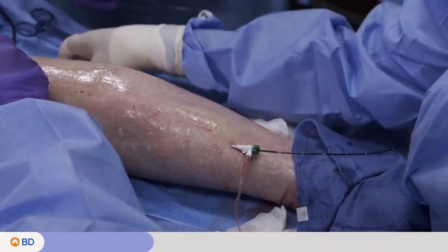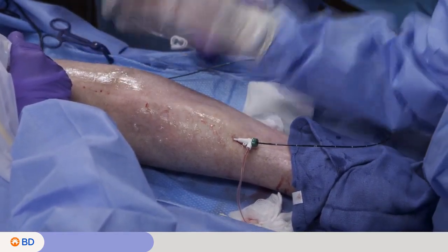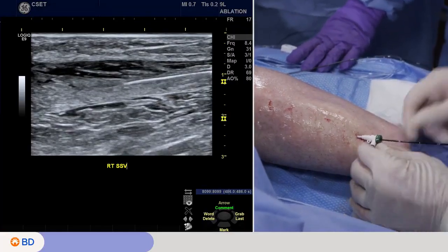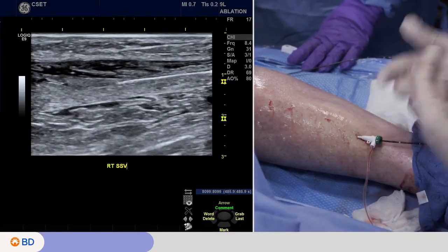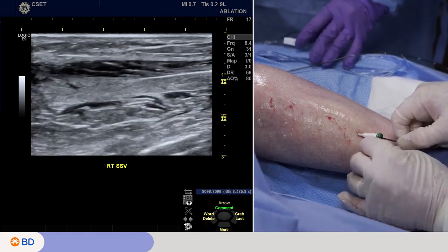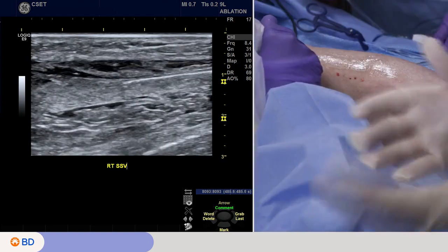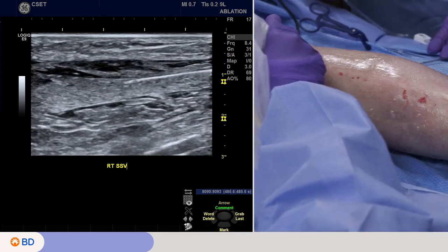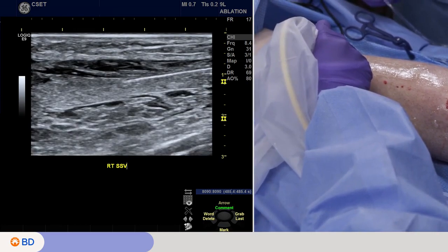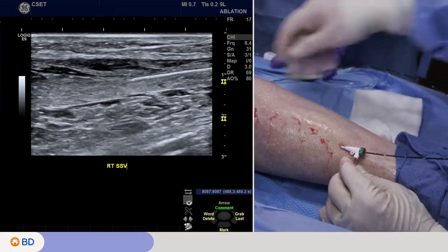So we want to move pretty quickly once we have the tumescence in, just so it doesn't dissipate. And it's very important to triple check your position at the top and where you're going to be initiating, because you might have inadvertently pushed the catheter in, the patient moved, and you certainly can't turn back. Once you hit the button, you're heating. So I'm just going to jiggle a little bit. I always confirm with my sonographer so that we have 2 opinions on that, and if we disagree, we have to convince each other where the tip is. So it's vital we see that marker. We're very confident we're in perfect position.